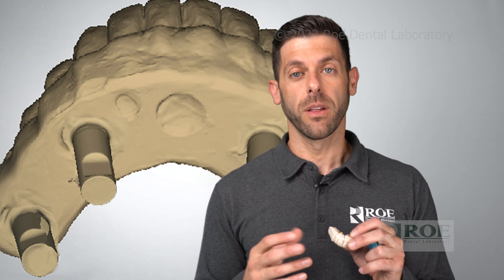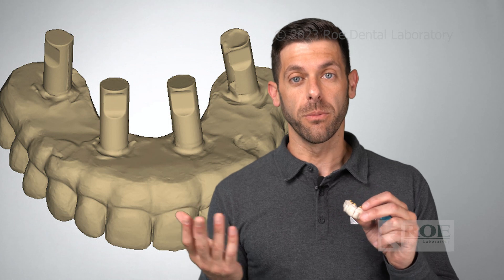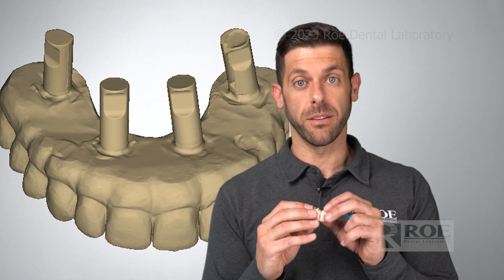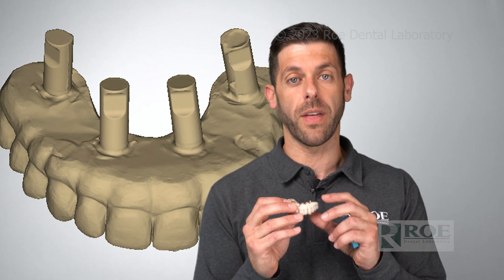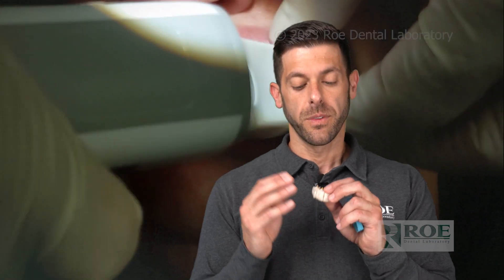Then you're going to adjust the occlusion, so dial this bite in. We already have the vertical because we have a 360 scan of the patient's existing prosthesis, so we don't need to do any kind of bite rim or anything like that — it's already been established. Dial the bite in, scan the opposing, and scan the bite.